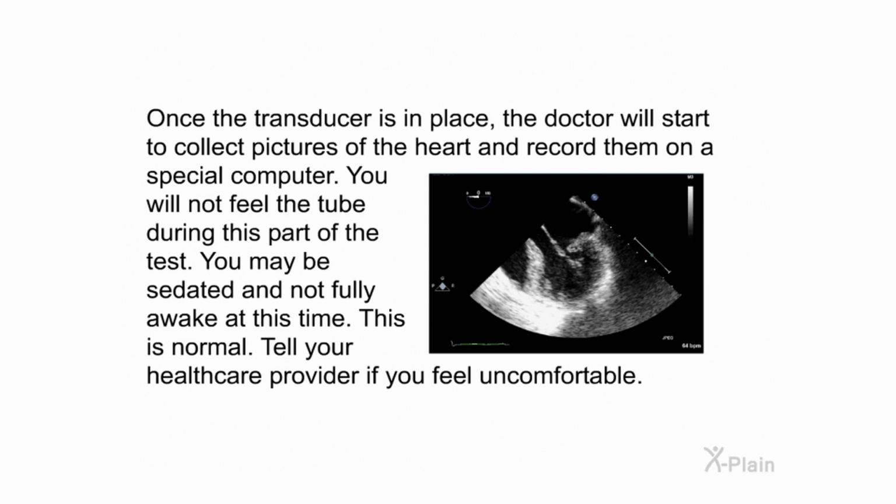Once the transducer is in place, the doctor will start to collect pictures of the heart and record them on a special computer. You will not feel the tube during this part of the test. You may be sedated and not fully awake at this time. This is normal. Tell your healthcare provider if you feel uncomfortable.